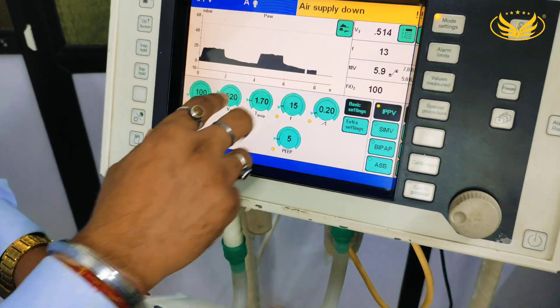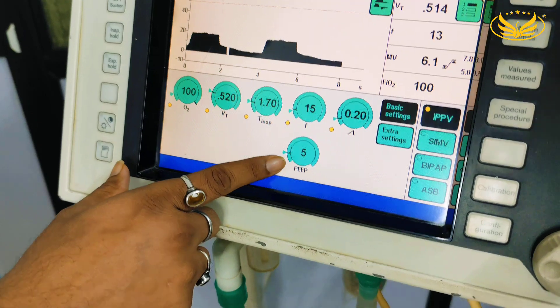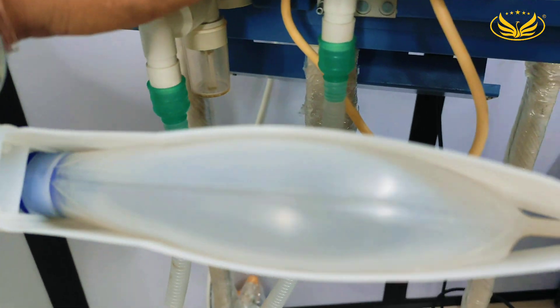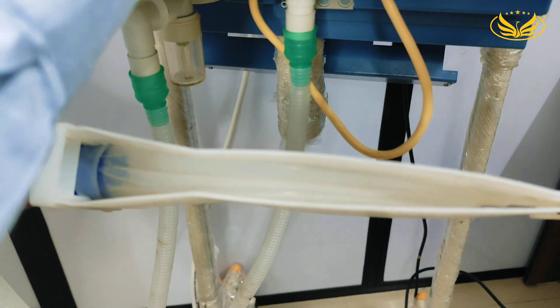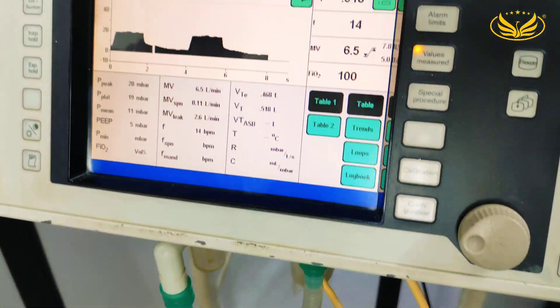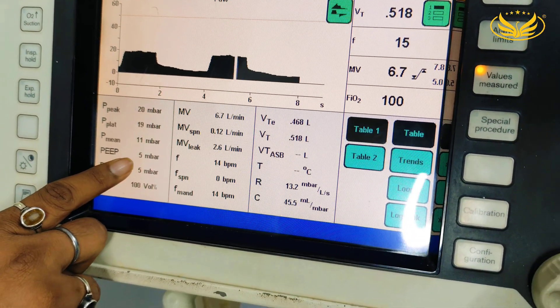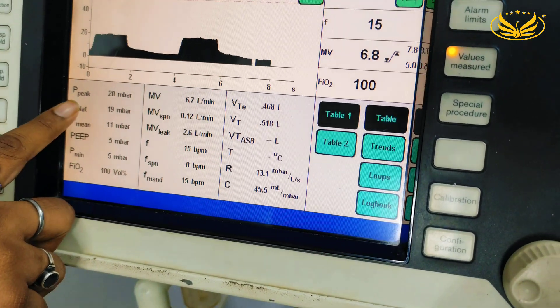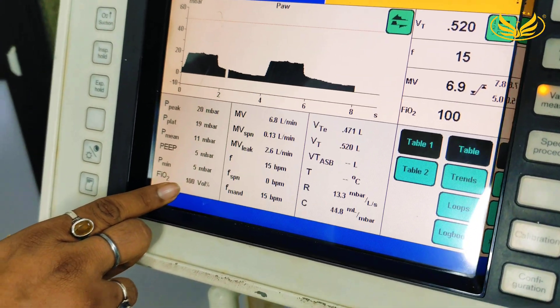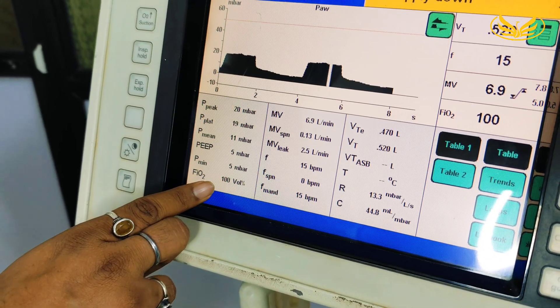So exactly it is matching. The PEEP we have set is 5 — you can see PEEP here also. From here you can check the monitoring values. PEEP we have kept at 5, so 5 is getting delivered. FiO2, as I said I have kept 100%, so 100% is getting delivered.